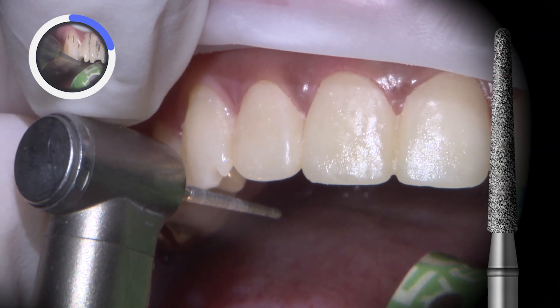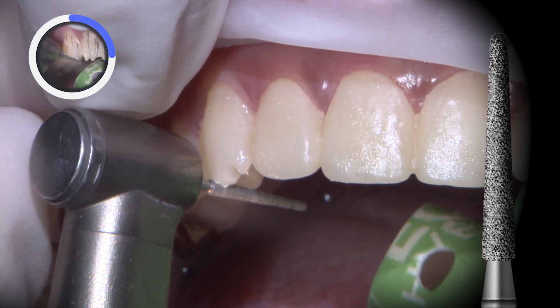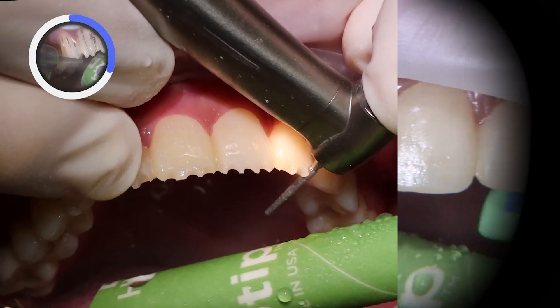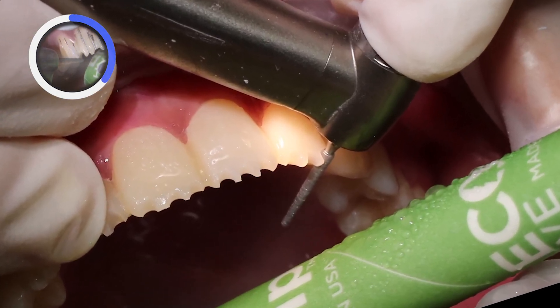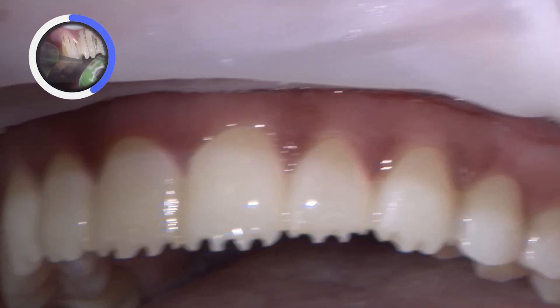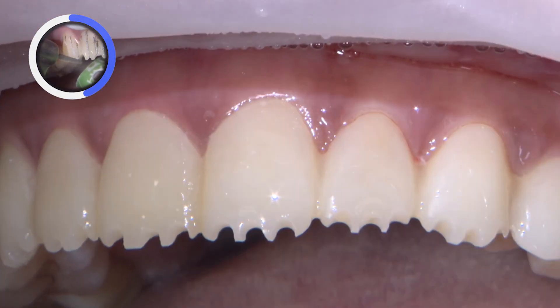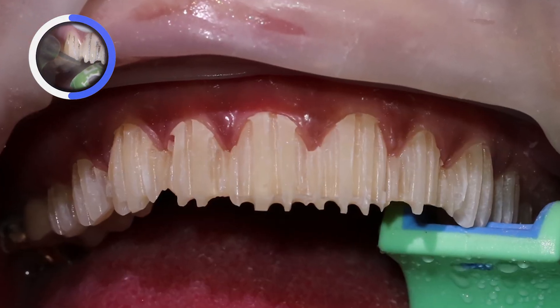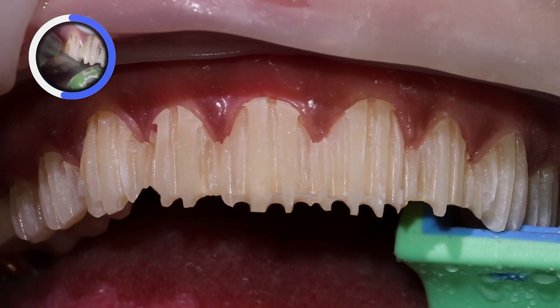I'm using the head of a 850-014 burr to create three depth cuts along the incisal edges of each tooth. For the facial depth cuts, I first ensure that the tip, which is 0.8 millimeters in diameter, begins the depth cuts at the margins and then gradually connects to the incisal. I place five depth cuts on the facial — three near the center and one along each line angle.